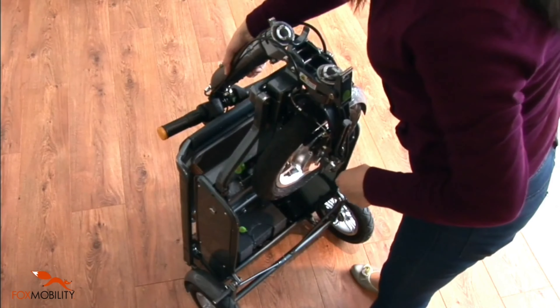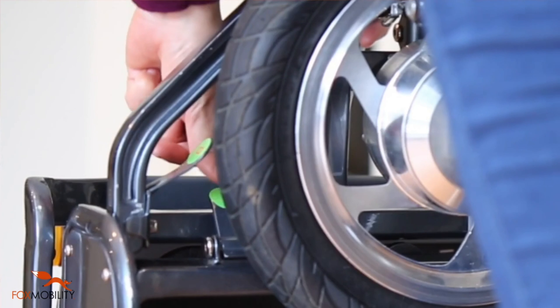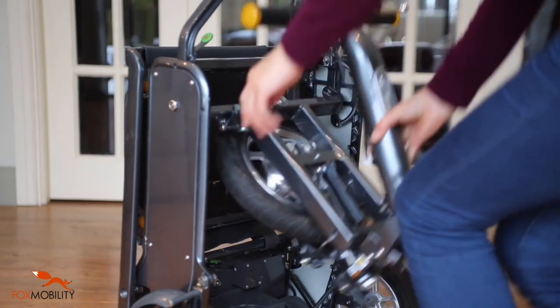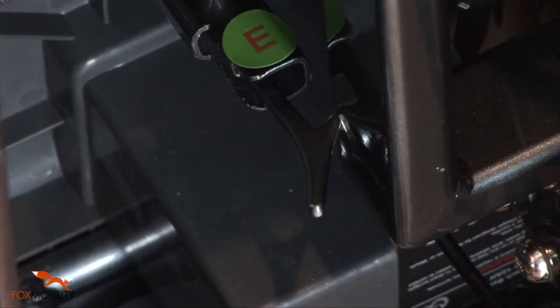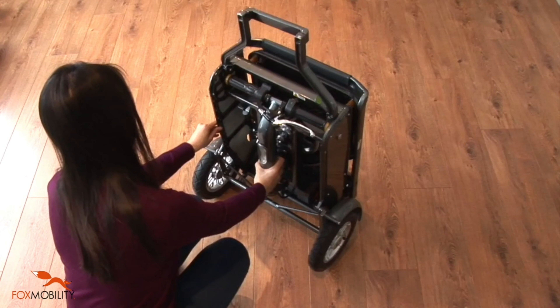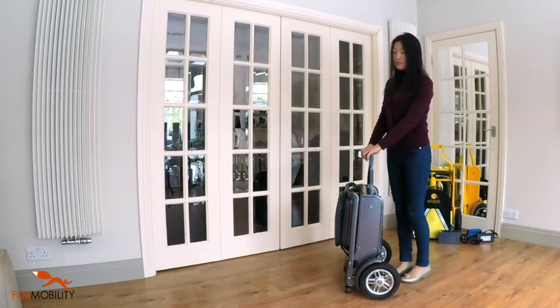Lift the handlebar assembly with your right hand. Release latch D with your left hand by pushing it down. Lift the handlebar assembly over the pulling handle. Lower the front wheel and front subframe together until it has engaged with latch E. Make sure the magnetic lock of the handlebar is properly engaged. Now the eFoldie is fully folded into a suitcase.